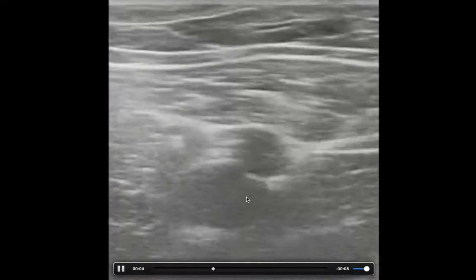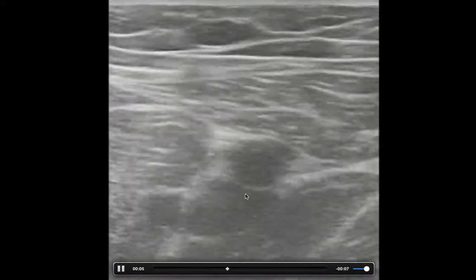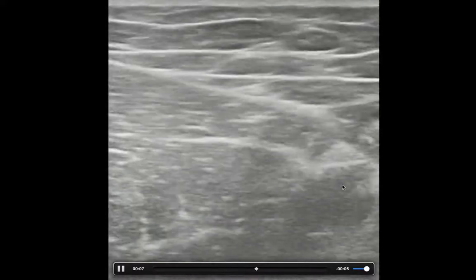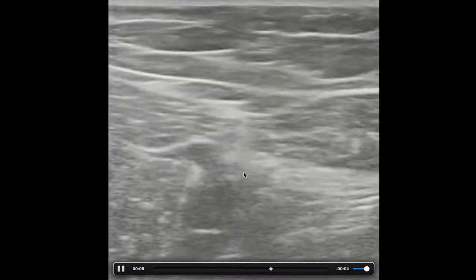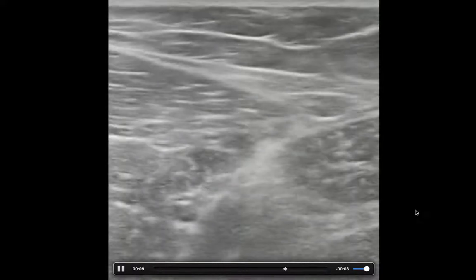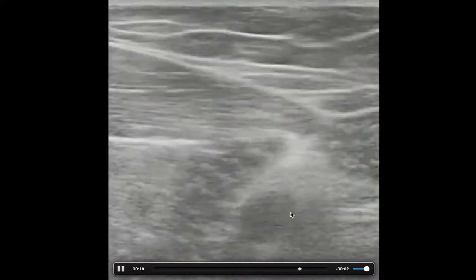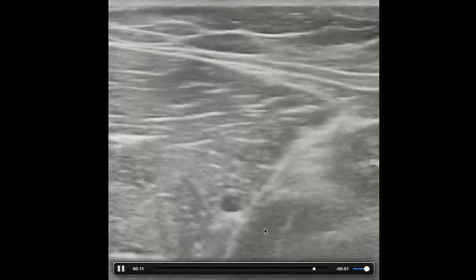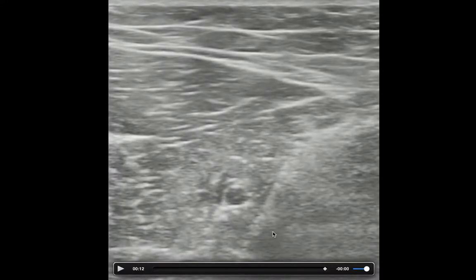And we just keep following that down, all the way down. Over here is the femoral artery still. Keep following that until it dips into the adductor canal about right there.